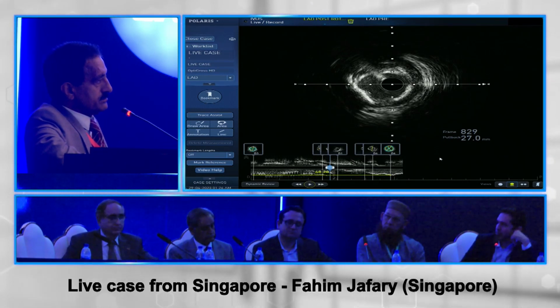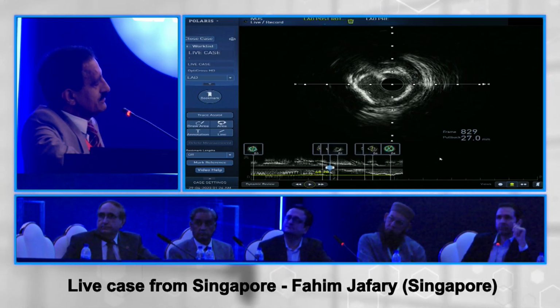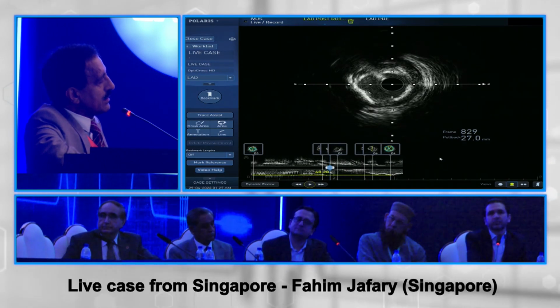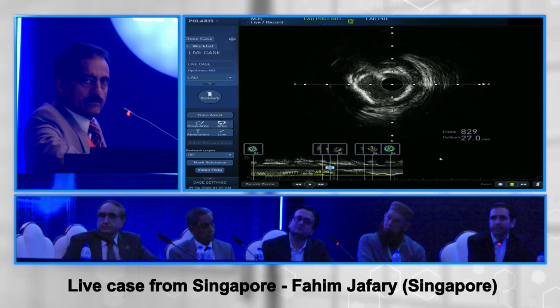Asad, what were your thoughts on that IVUS plan? Fahim, did you hear the question? Yeah, so if I heard the question correctly, why do ROTA and why not IVL? So we debated that also in our mind.